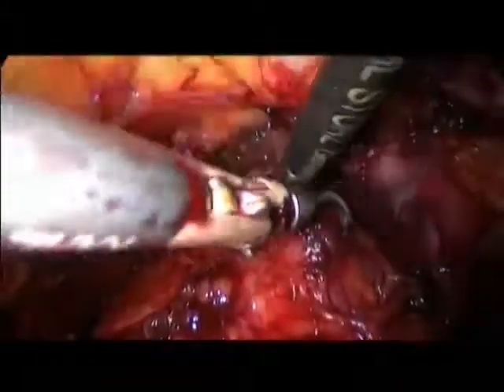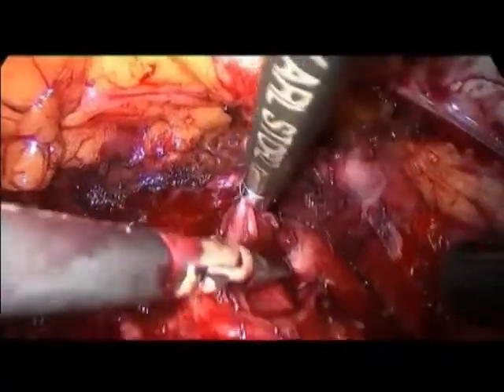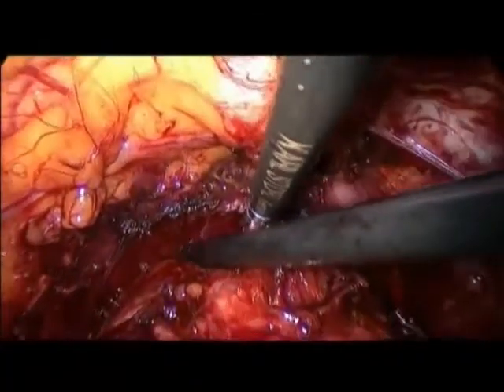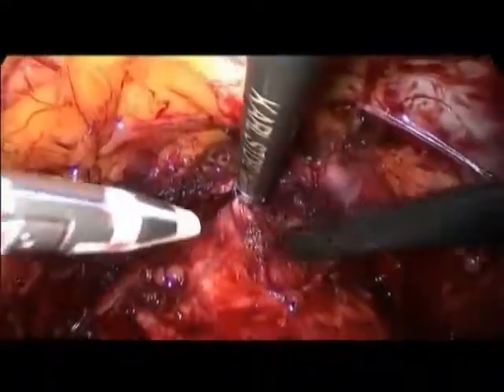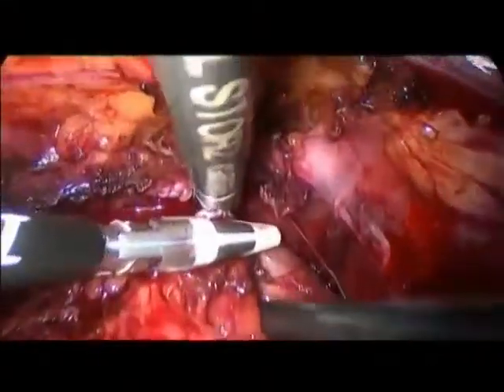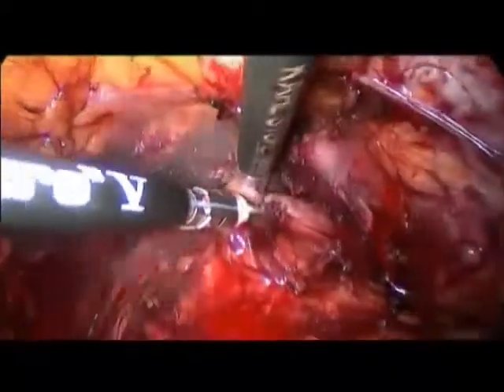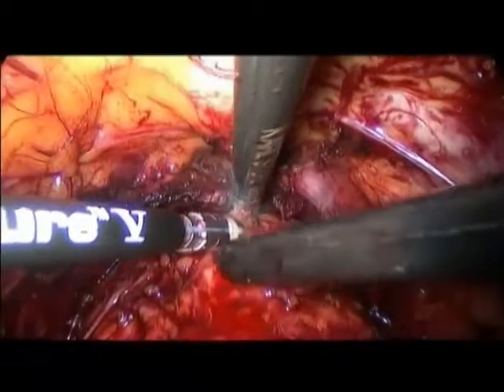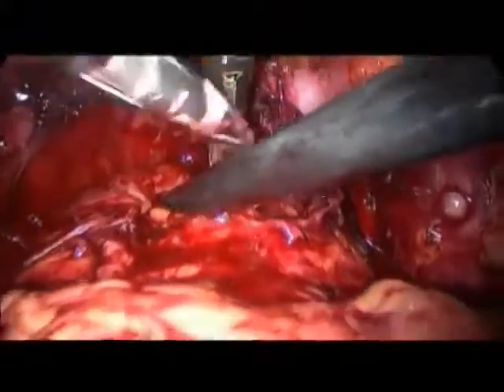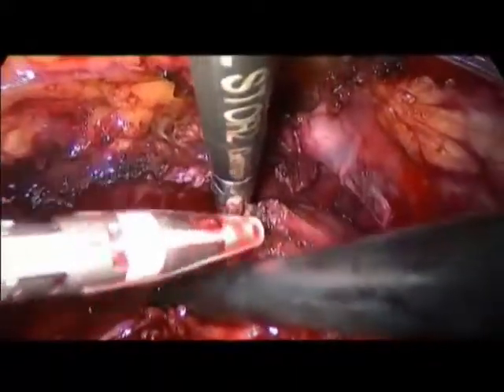Maybe in that case we will combine hemostasis for the back flows with the division as close as possible to the forceps, and we will place a stitch on the forceps just thereafter. And so this is now ligature's time. Yes, this is ligature's time. Generally, I do it with the scissors, but this is a very bad moment for the scissors because you are using a lot of diathermy, and this is not good for the sharpness of your scissors when you need them in a cold use later on, and mainly during the bundle dissection, sometimes they are already out of order.